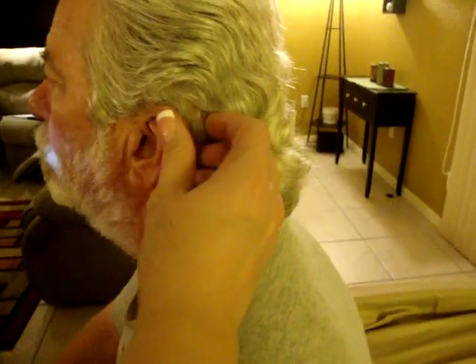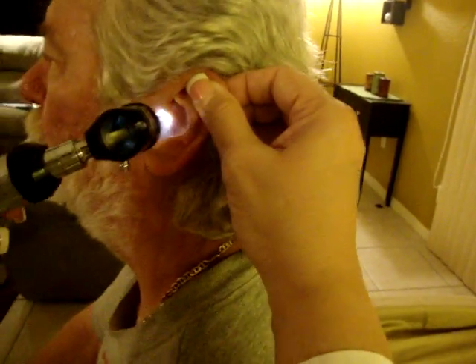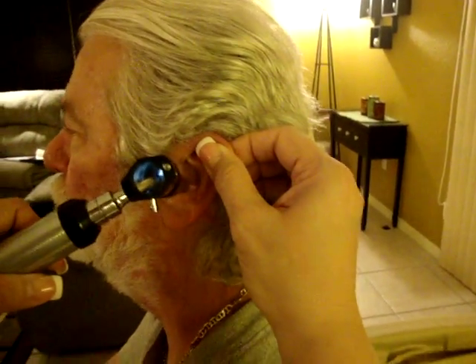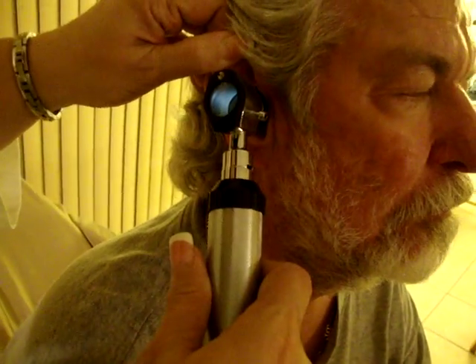Then we're going to be looking into your ears. We want to look at the tympanic membrane for pearly gray. We're looking for the umbo, the handle of malleus, and the light reflex. We're going to be pulling your auricle up and back. Great. And the same thing here, pulling it up and back. We're looking in.